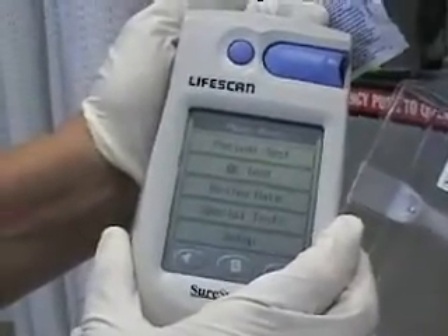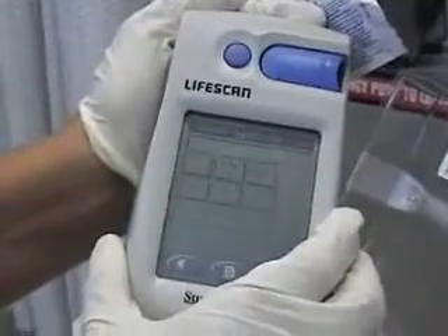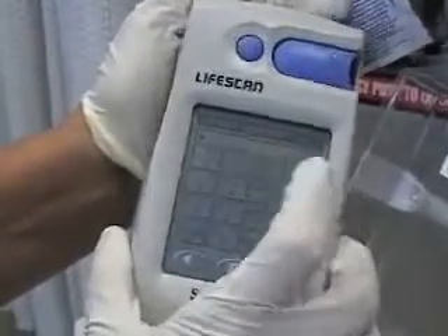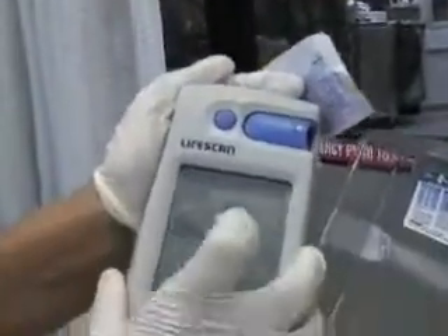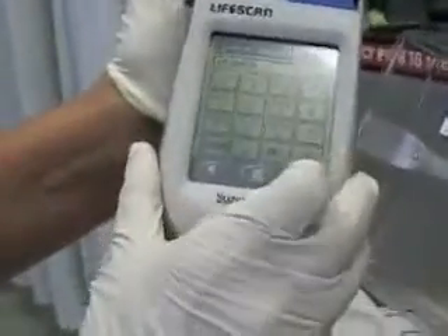We're going to do a patient test. We're going to enter operator ID. That's my number. Everybody has their own number they're given when they start. Hit okay.